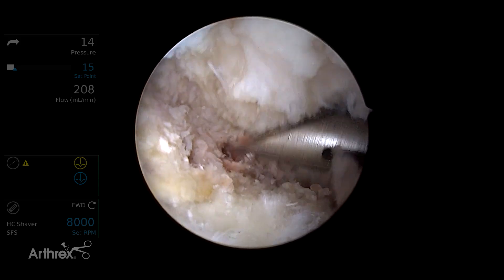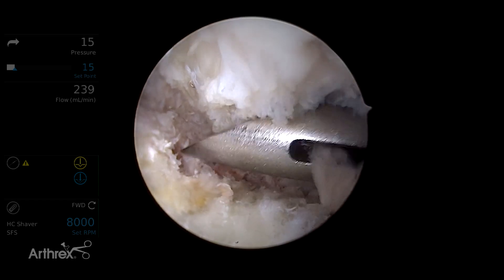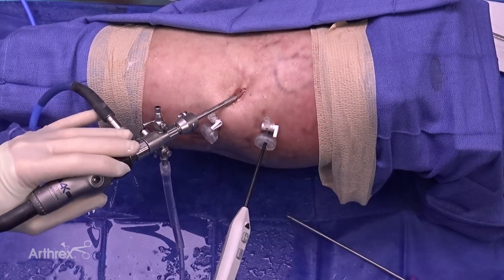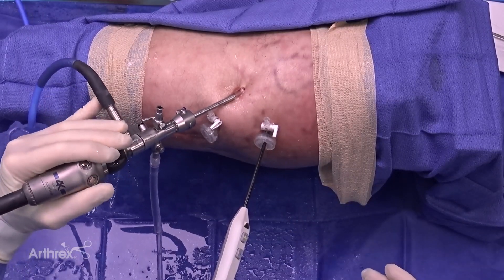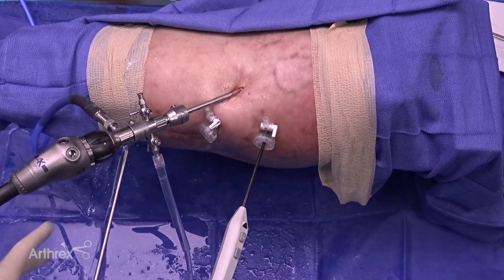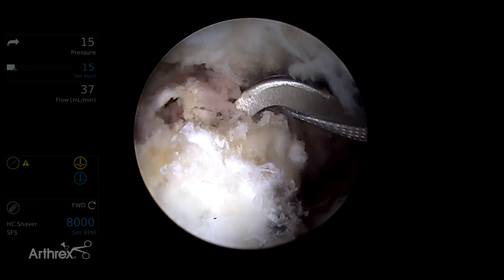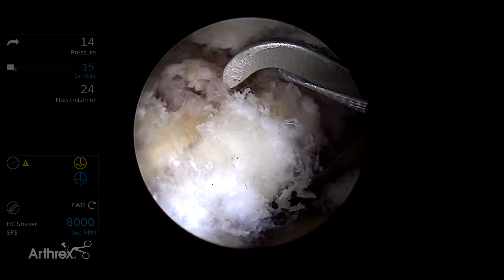This allows identification of the holes to easily place the push lock anchors. Once this is done, the guide can be removed. The next step is placement of suture tape circumferentially. I prefer a circumferential labral repair, as this allows me to appropriately control the labrum while minimizing labral eversion.